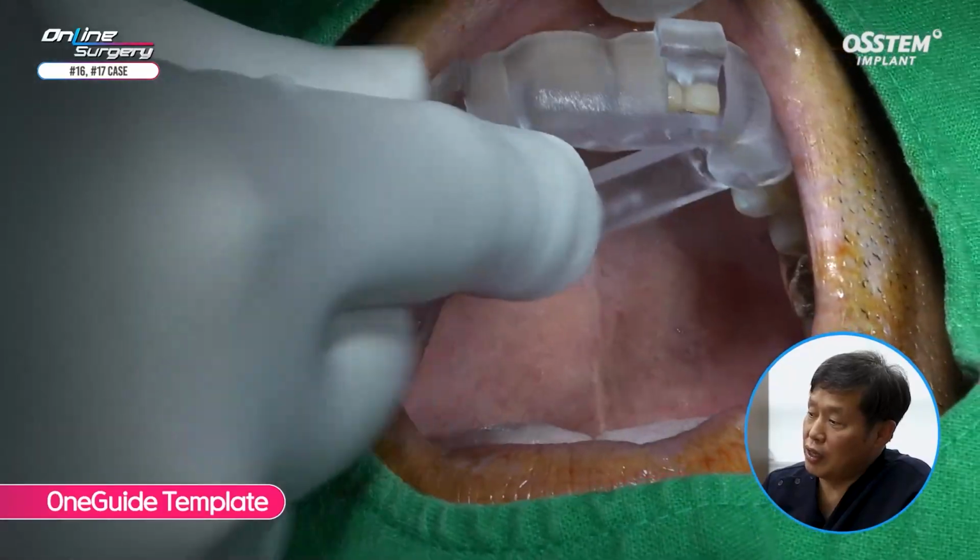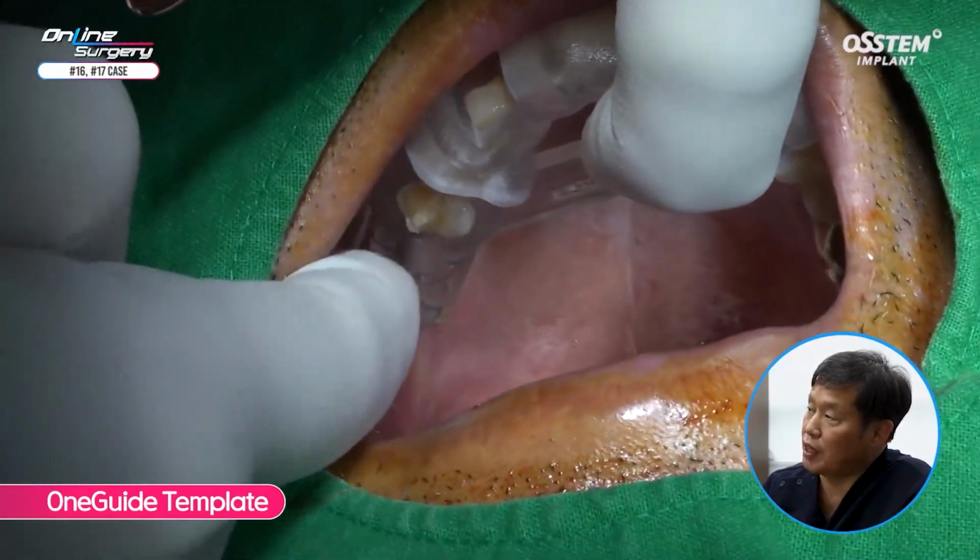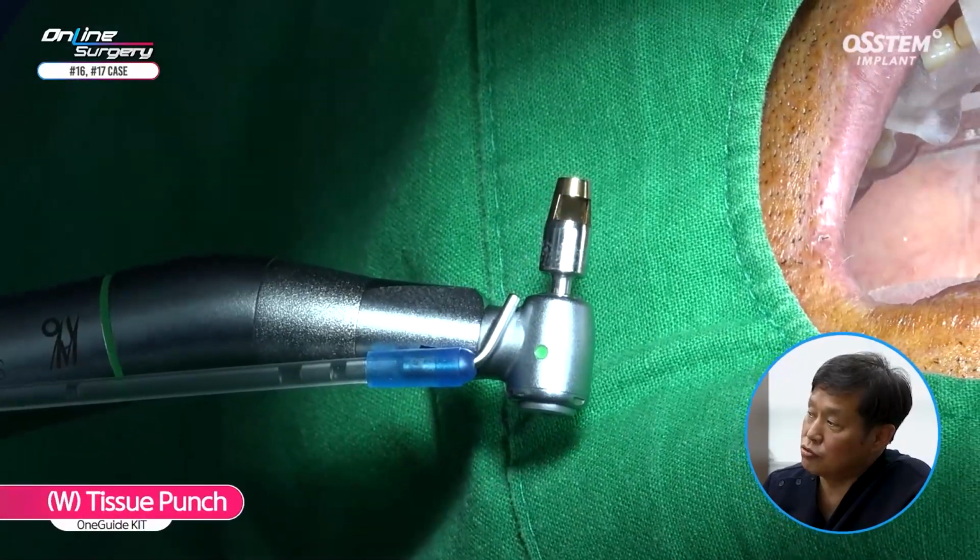The guide is adapted. OneCAS is used here. Tissue punch is used to remove overriding mucosa.